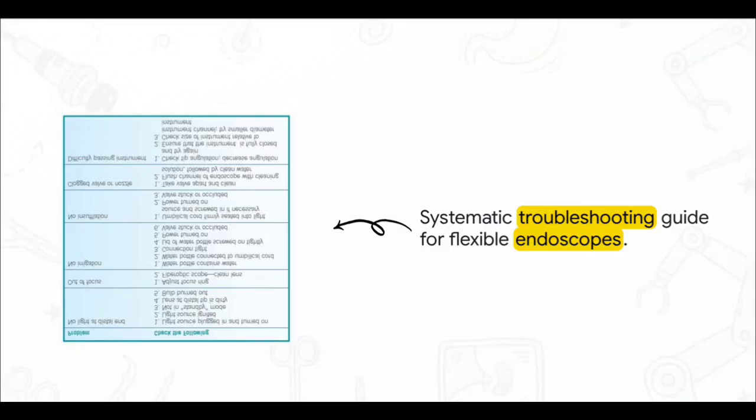And just like with laparoscopy, you need to know how to systematically troubleshoot. Say you have absolutely no insufflation. Well, your umbilical cord might not be fully seated, or maybe the valve is just stuck. If you've got a clogged valve, you literally need to take the whole thing apart, clean it, and flush the channel out. Guys, these are classic super high-yield simulator and board exam scenarios, so lock them in.